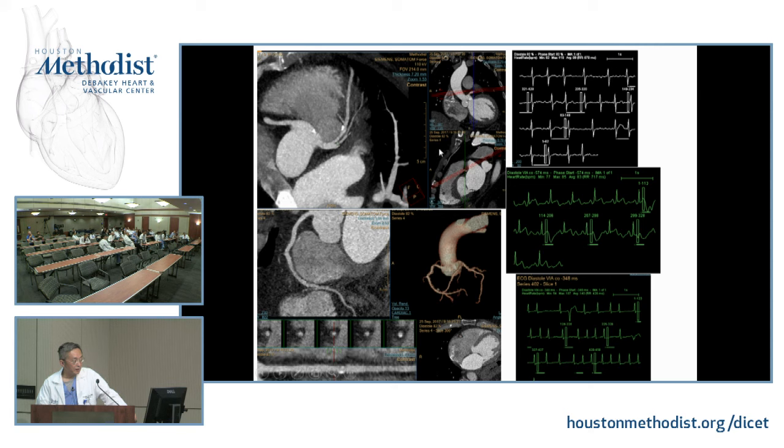Okay, so what do you think? Can you tell from this study if it's AFib or not? Honestly, from the study, you can't tell if it's AFib or not, in my opinion. With the old scanner, you'd be able to tell because it's really irregular. Remember we said earlier, you're going to have a lot of step artifact, right? Because each time you go around the heart, you're looking at a different part of the cardiac cycle. Because it's so irregular, right? This one could fall into systole, diastole, like this one is very different, okay?